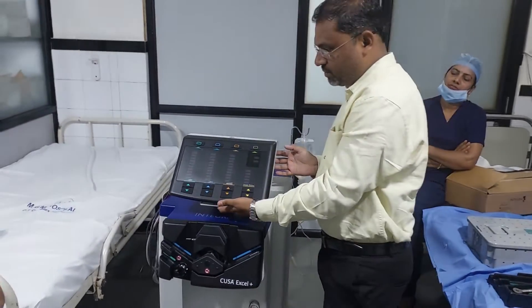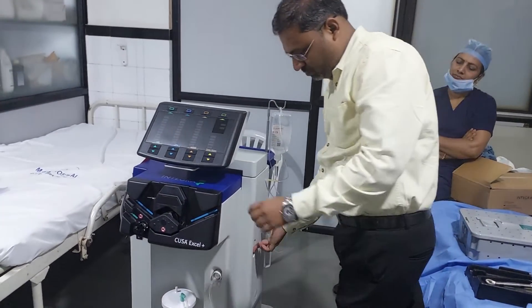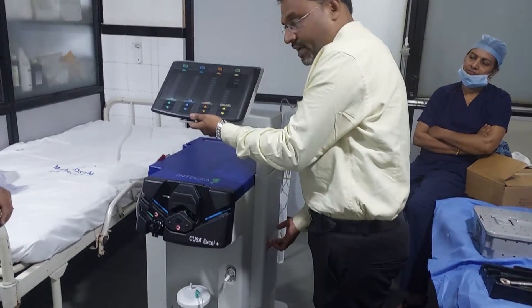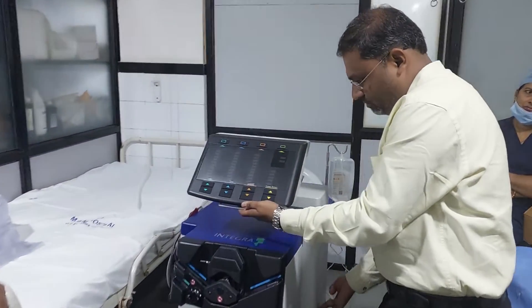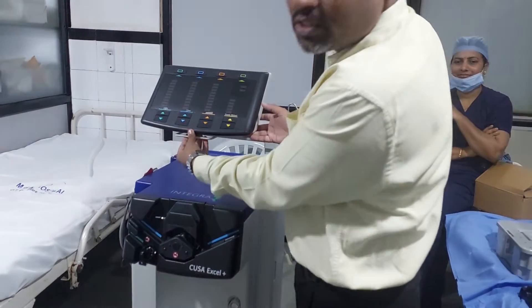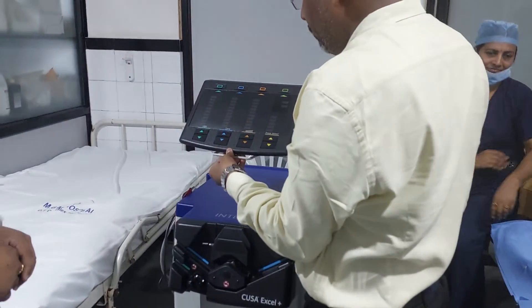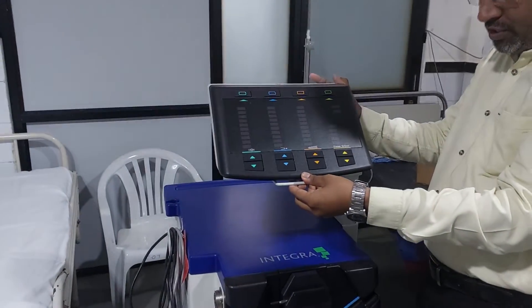Suppose you want to adjust the machine position up and down — they have provided a knob. Just push it for up and down movement. When it comes up and you want to tilt it, they have provided another knob. Just press it and you can tilt it according to the convenience of surgery.